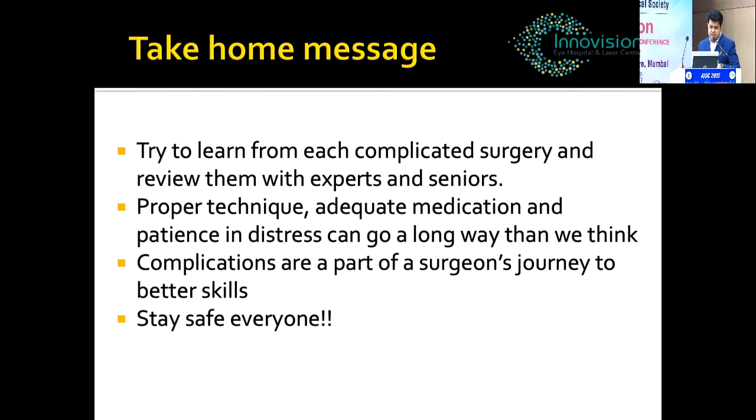Lastly, my last slide, I'll just take a minute. It is important to learn from our complications, and complications are a part of being a surgeon. Iris claw is one of my first secondary IOLs. And that's my talk.